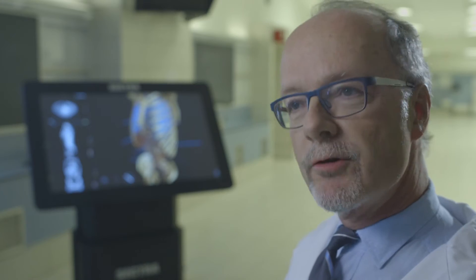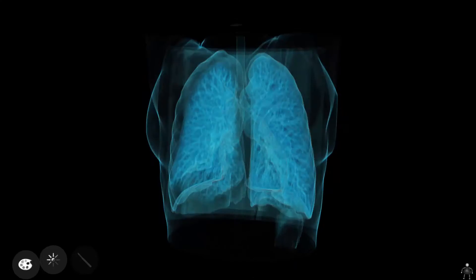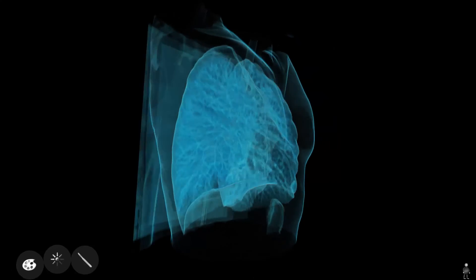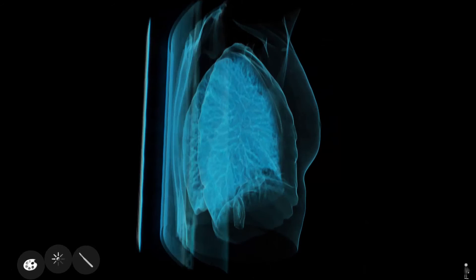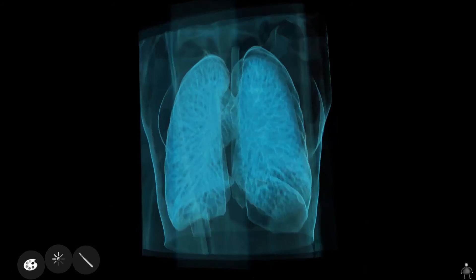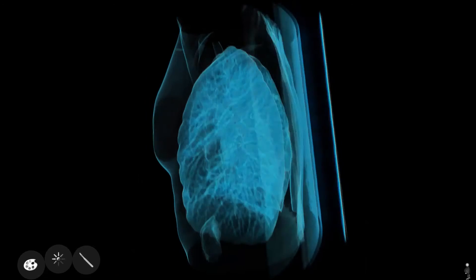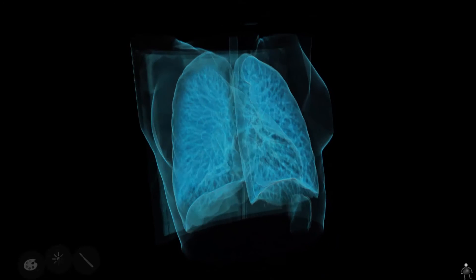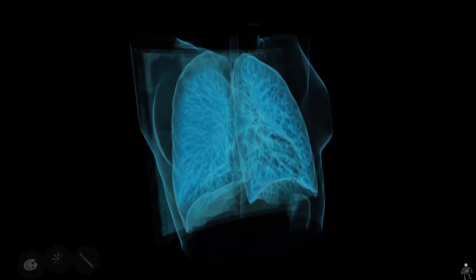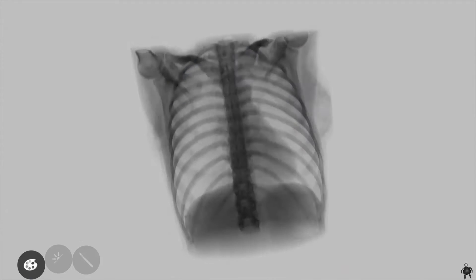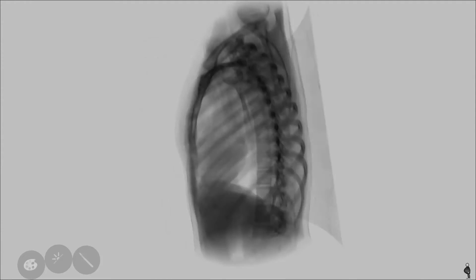Cadavers come with certain diseases that students find every year, but it's rather random. What we can do with the anatomy table is take a more strategic approach to the understanding of disease and load up images from the diseases that we're covering at the time.